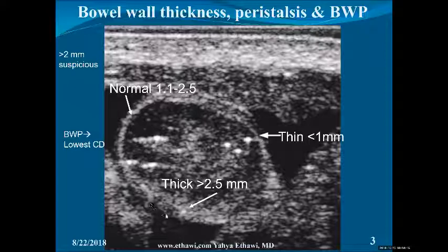You can see here it starts to become thick. Okay. And you can see also here thick and starting to separate, becoming sloughed. And you can see the color of the bowel change. And here it is already sloughed, and probably air is ready to escape. And you can see also here an increase in the thickness.